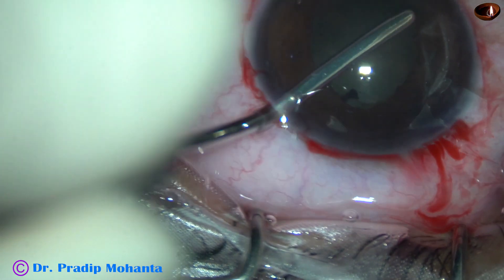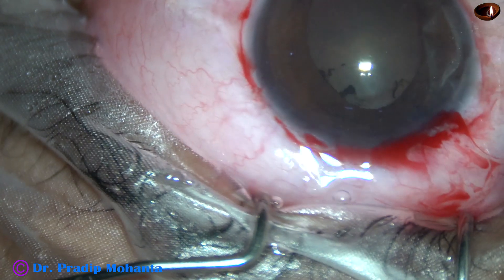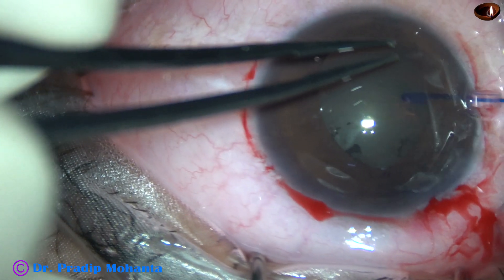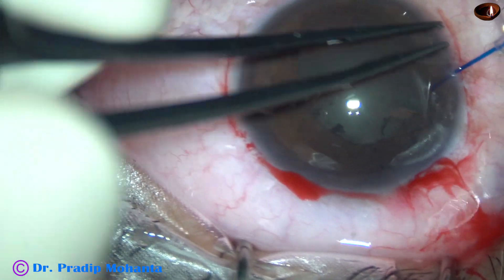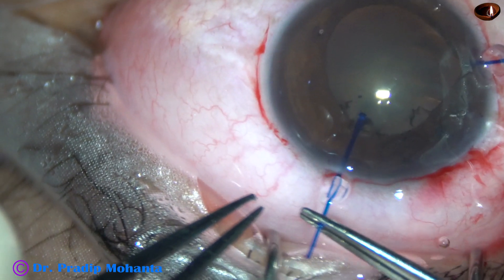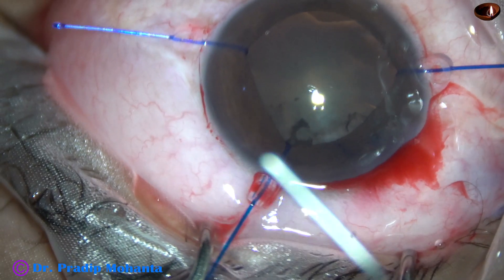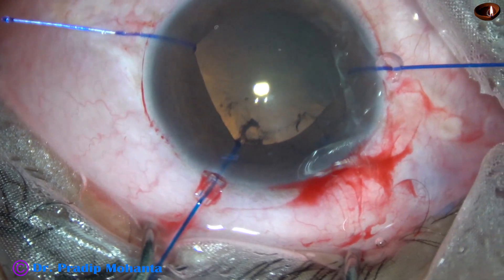In this case, I didn't want to use B-hex because the pupil has dilated well in the 6 o'clock area. The iris hook at 9 o'clock is placed. One more iris hook is placed at 12:30. I had to attempt several times to place the hook. And one more is placed at 4 o'clock.